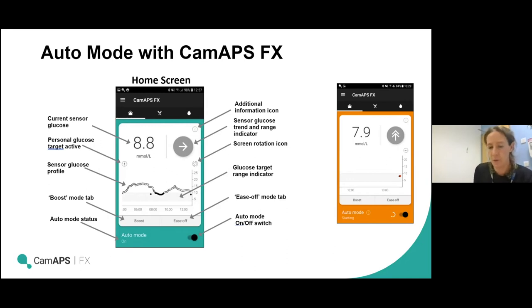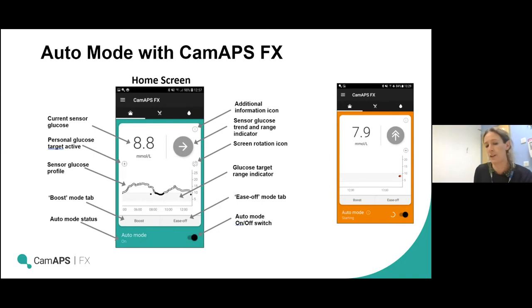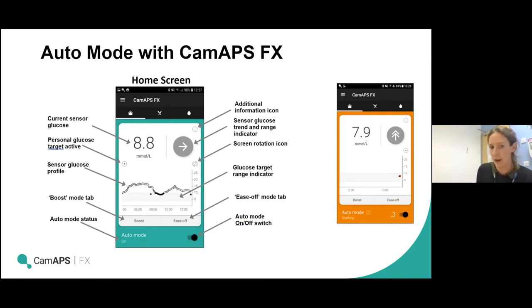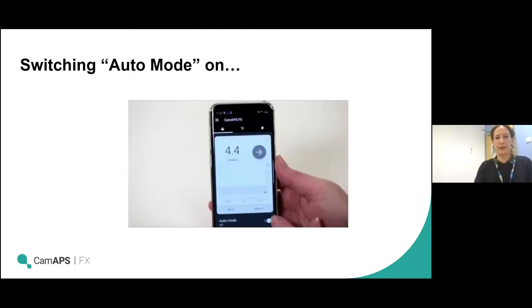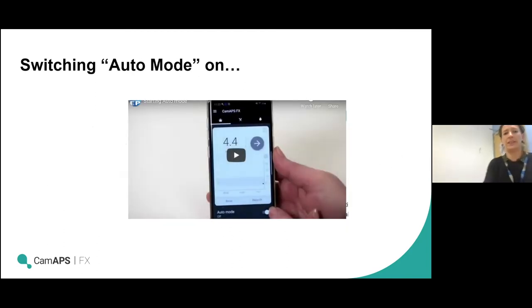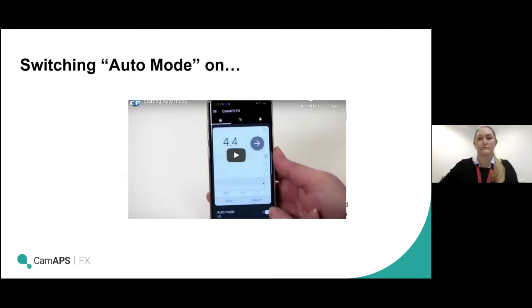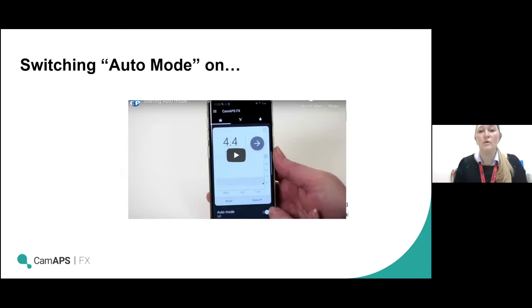Other things of interest on the home screen: the knife and fork icon at the top is where you bolus from, which Sara will take you through shortly. You can see the glucose trend and the two functions called boost and ease off, which we'll go through — what those mean and when they might be used.